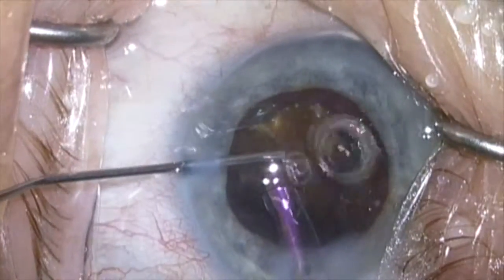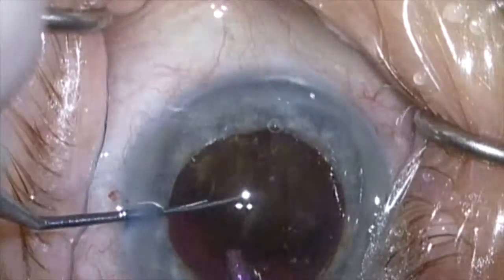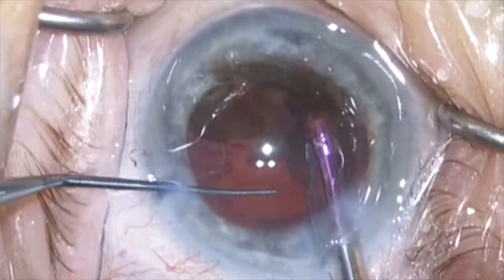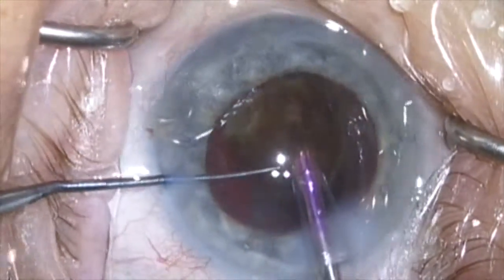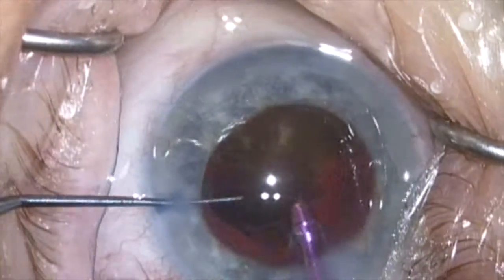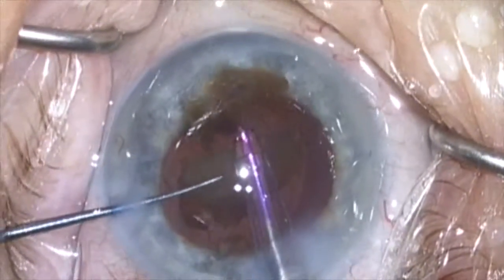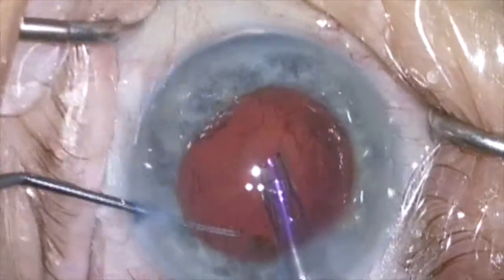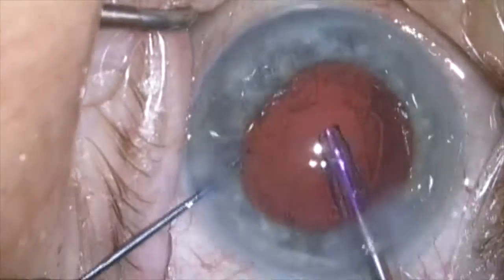More viscoelastic is being placed to protect the cornea endothelium, and the final quadrant of this rather impressive nucleus will be removed. I think it's very important to keep an eye out for any loose fragments or chips to make sure they're not left behind — that's something pretty easy to miss in a blue eye with this kind of dense nucleus.